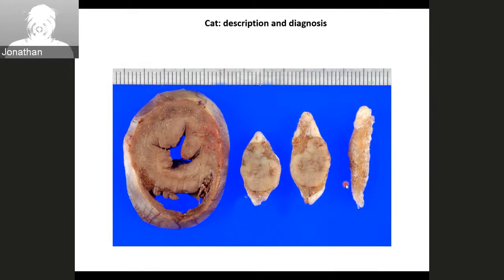And obviously, if I correlate this to the heart on the left and the gross pathology, there is probably thyrotoxicosis, with moderate hypertrophy of the left ventricle, which is symmetrical, involving the interventricular septum and the free wall, maybe a little bit more the free wall actually.